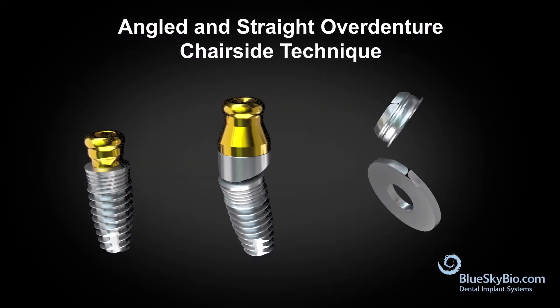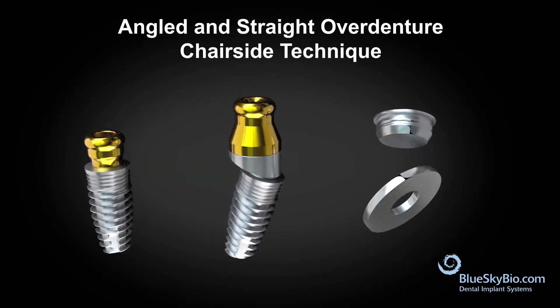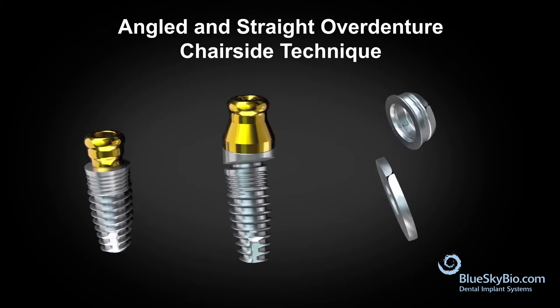This video shows how to perform an angled and straight over denture chair side technique using the BlueSky Bioimplant system.